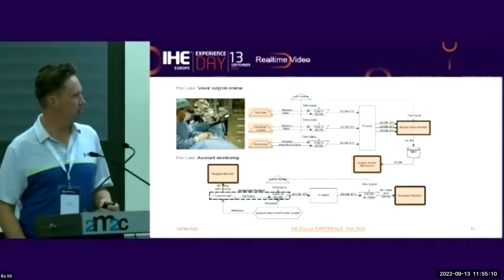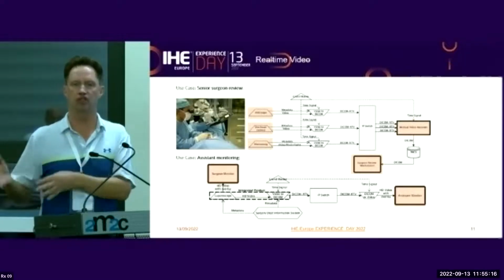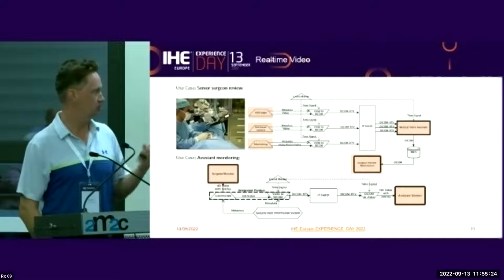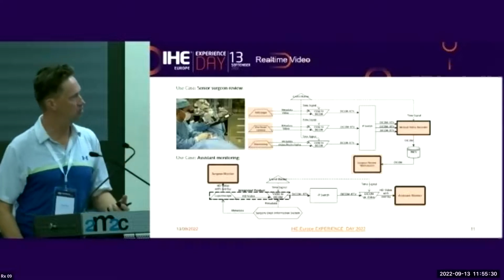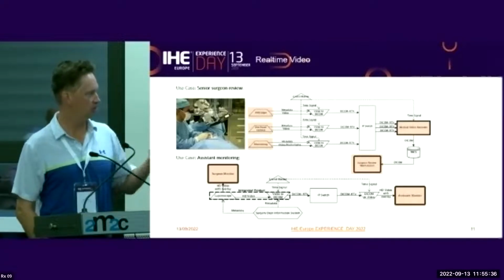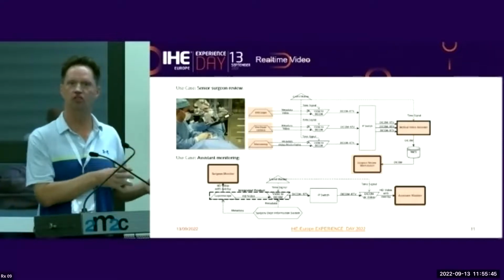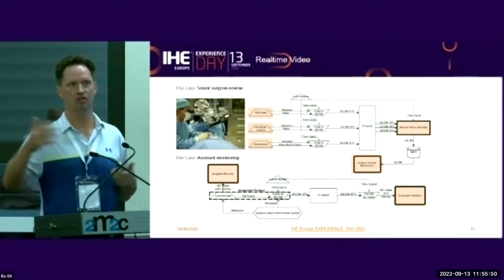A second use case would be during the surgery, you want to have an assistant surgeon outside of the surgery room being able to assist, but to see exactly the same videos or the same feed as the surgeon in the room sees. So that would be two things where this is done. And as we discussed this supplement at the time, it was really interesting with an example where this assistant surgeon wasn't even in the same country. So they were performing it, I think, in Europe, and they were doing the assistance in the US, or the opposite, I don't remember. So that was really interesting, that you can do real-time video across continents.